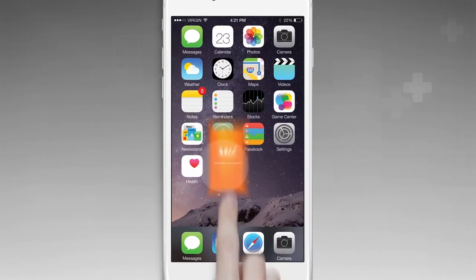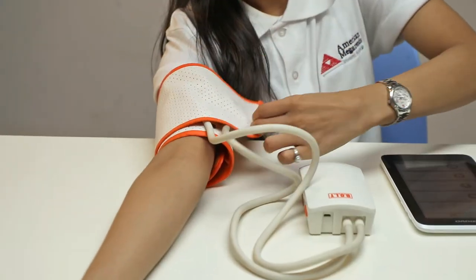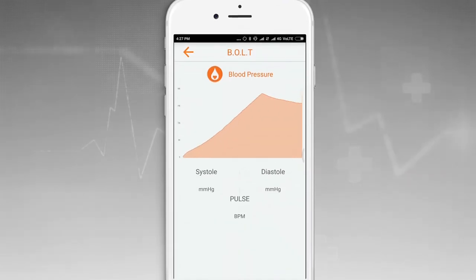Now, launch the Bolt application. Position the Bolt cuff in your upper right arm about 1 inch or 2 cm above your elbow. Select the blood pressure option in the app.